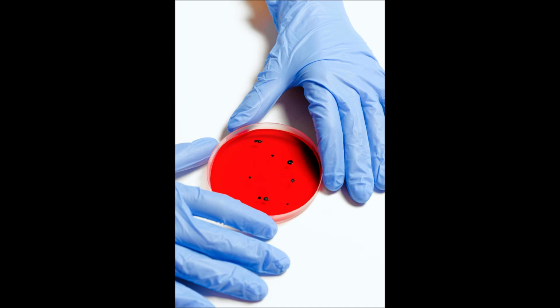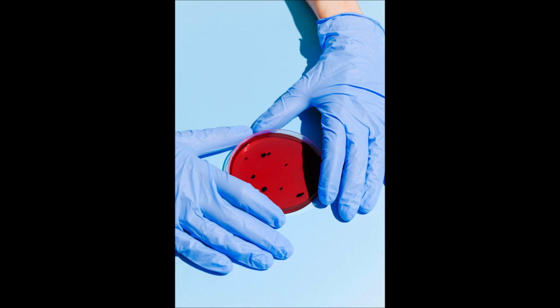Hello, I heard your question. What this method does is to amplify small fragments of the gene and sequence the fragments, and compare the sequence to reference sequences in a database.